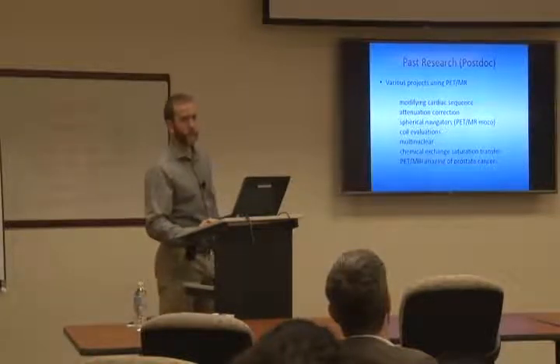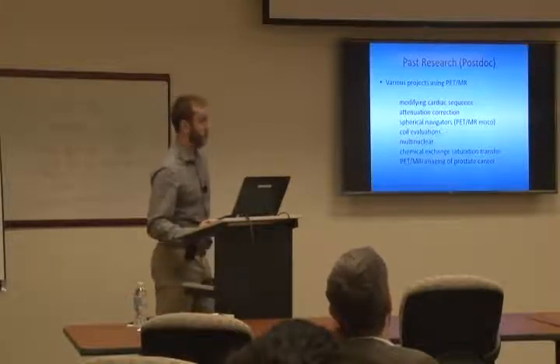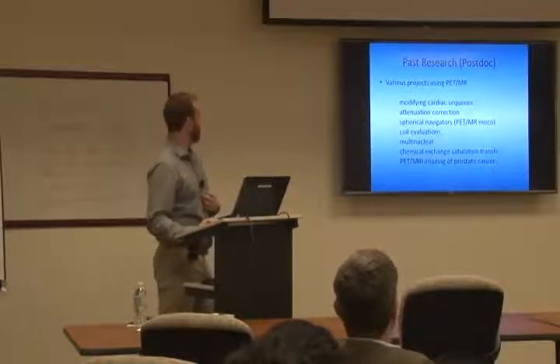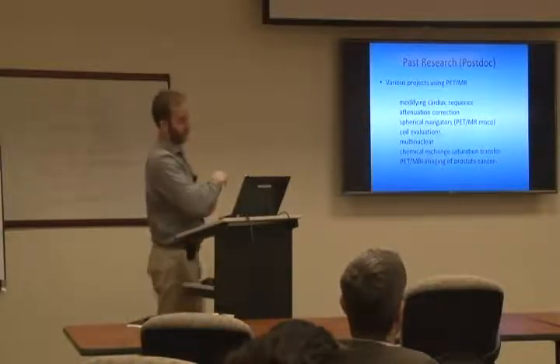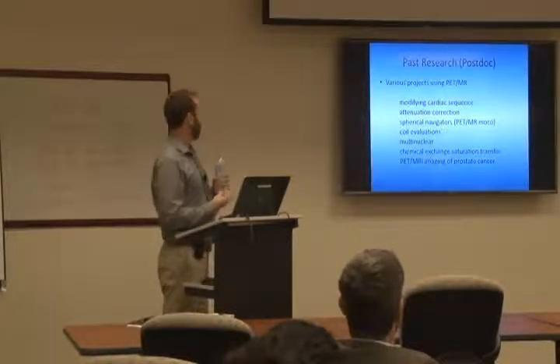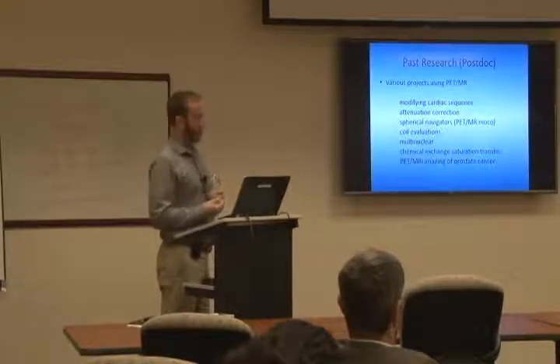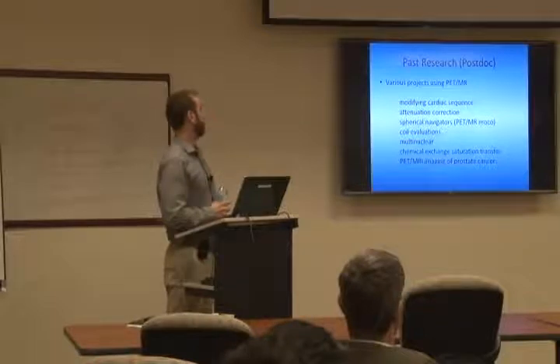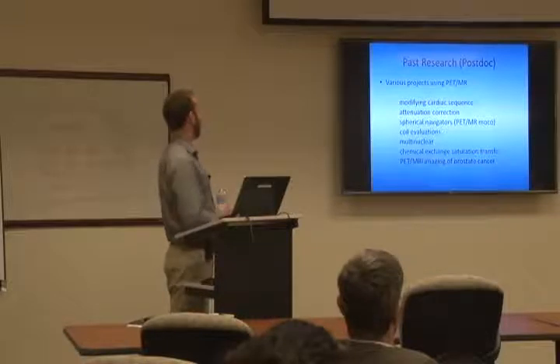I was modifying a cardiac sequence to add a saturation pulse that would clean up the B1 inhomogeneities. We were working on extending attenuation correction to the whole body. The current methods are very good at correcting for attenuation in the skull, but we wanted to extend it to the whole body. So we actually worked with a guy that came over from Copenhagen on that. One project I spent a lot of time on was the spherical navigators, which was a motion correction technique, retrospective for PET and prospective for MR.